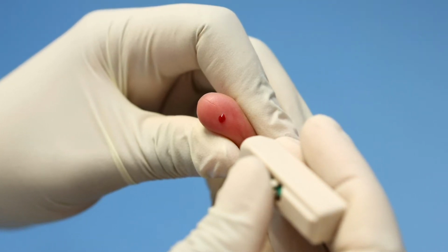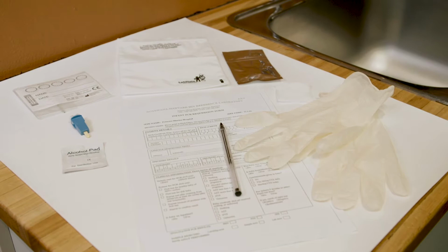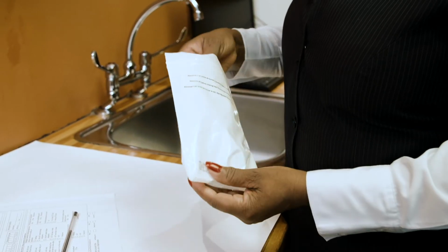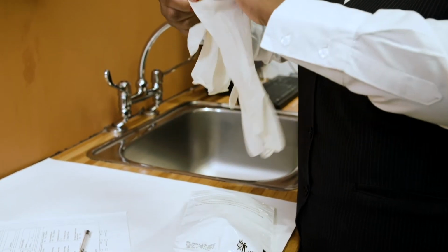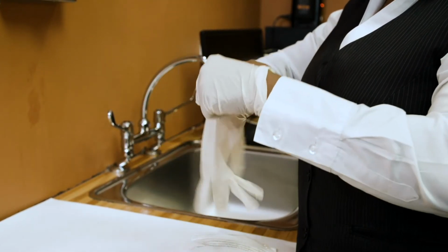We will begin our training by watching a nurse gather her supplies for a DBS collection using a finger prick. Keep in mind that the supplies used by your program may look slightly different from what is shown here. Your program may be using pre-packaged bundles with all the supplies needed for DBS collection. If your program does not use these bundles, you will have to gather the items separately.